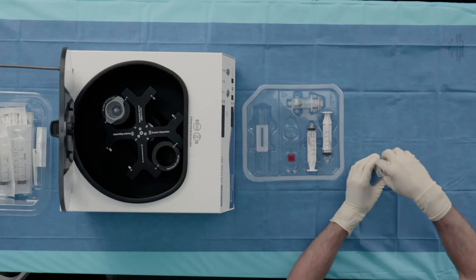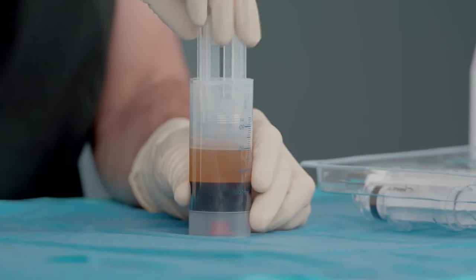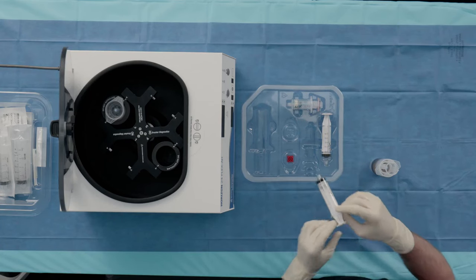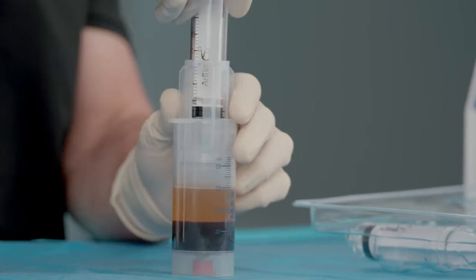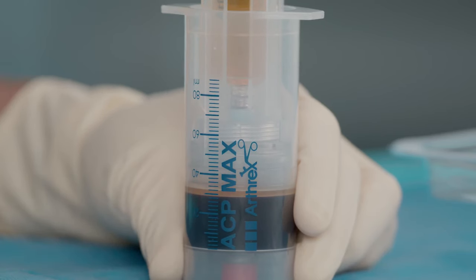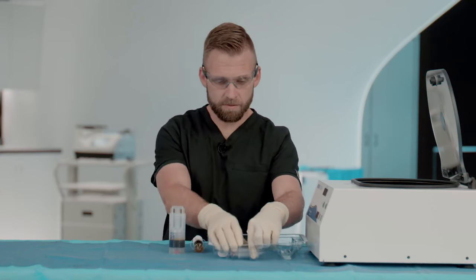We'll thread our syringe guide back on and withdraw the PPP layer, stopping two lines short of the red blood cell layer. Next, we'll attach the ACP syringe included in the kit and fill the syringe completely to 15 mLs.